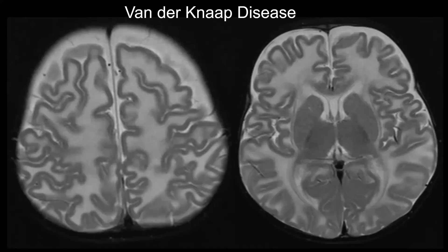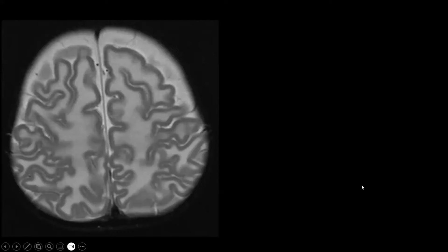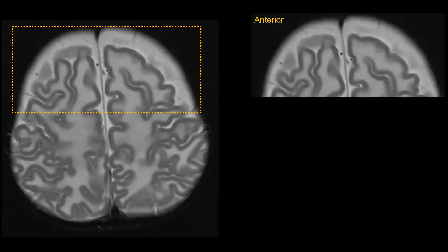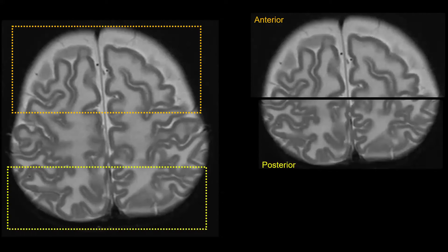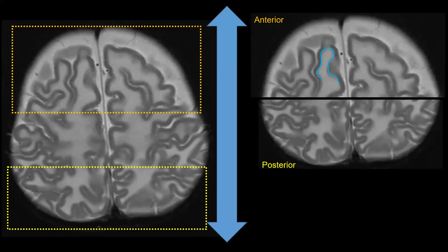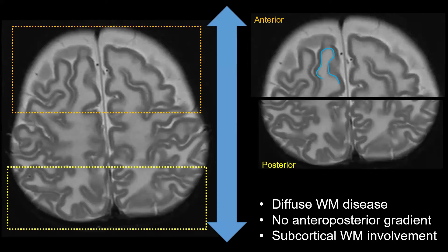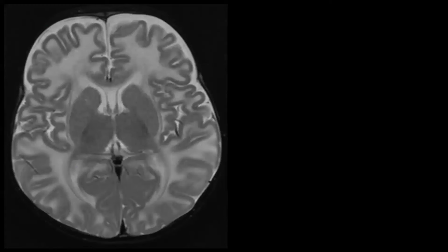This is a patient with van der Knaap disease — clearly the brain of a very young patient, with MRI performed during the first year of life. We see myelination of the posterior limb of the internal capsule and a bit of the corpus callosum at the level of the genu, but the supratentorial white matter signal is diffusely abnormal. Looking in more detail: the anterior brain is equally involved as the posterior brain, so there is no gradient. We have involvement of the subcortical U-fibers. To summarize: diffuse white matter abnormalities without a gradient and with subcortical white matter involvement.